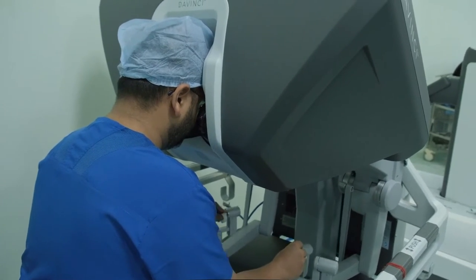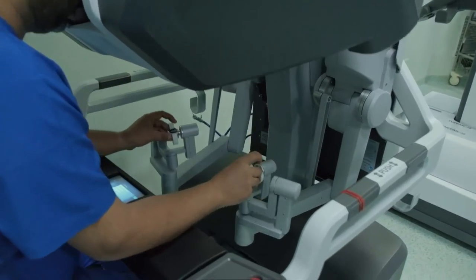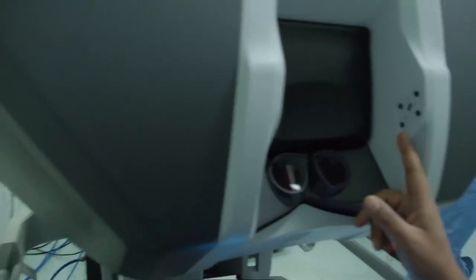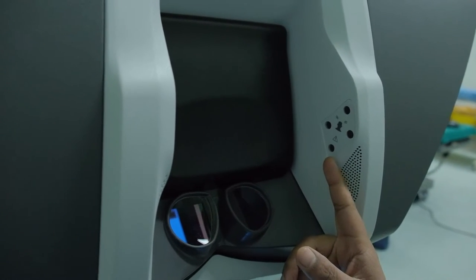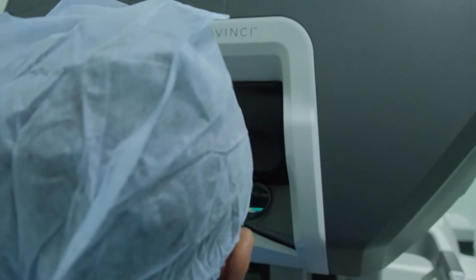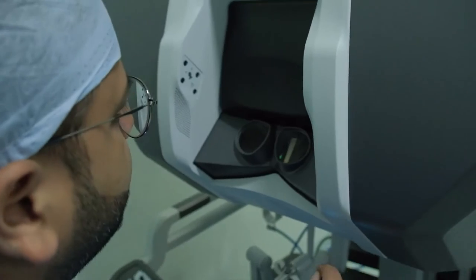And this is how we are going to control the instruments by looking into the screen. Here there are infrared sensors, and as soon as I put my head inside, it senses and it will activate the instruments. As soon as my head is out, it is going to deactivate the instruments so that there can be no movement of the instrument tips when the surgeon is not seeing into the stereo viewer.